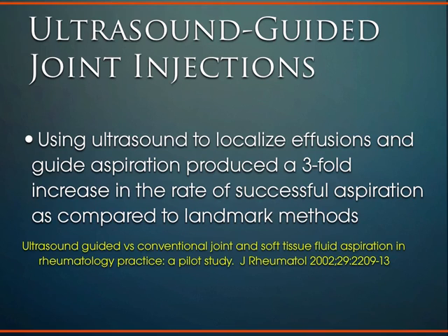You're not using fluoroscopy, which is a typical modality that guides injection treatment, but it's radiation exposure for not only the patient but also the practitioner who's doing it all day. You can't wheel the fluoroscopy machine in and out of all the rooms, and ultrasound guidance is very nice, very dynamic, and very useful. And what we'll start to see more of, and what's already in the literature, is that ultrasound guidance versus our traditional surface anatomy or blind injections is much, much more accurate.